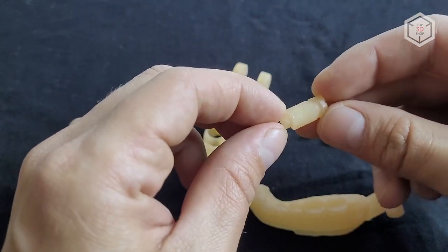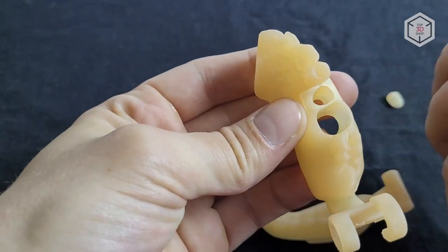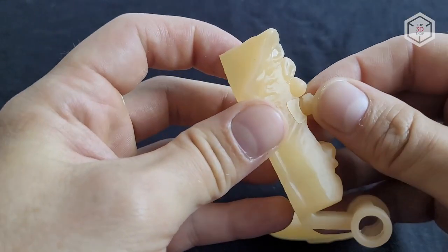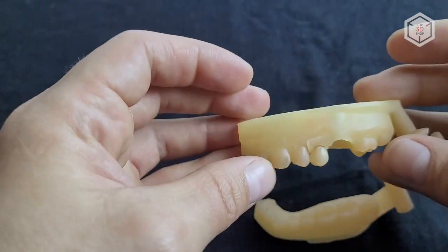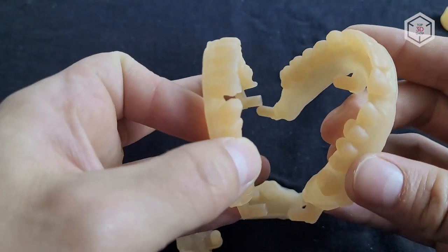The tooth from the second test print needed additional processing to remove the traces from the support structures and get a snug fit, while there were no issues with the crown, which fit perfectly. The master models from the third test print have special ledges and were designed simply to stand on top of each other.